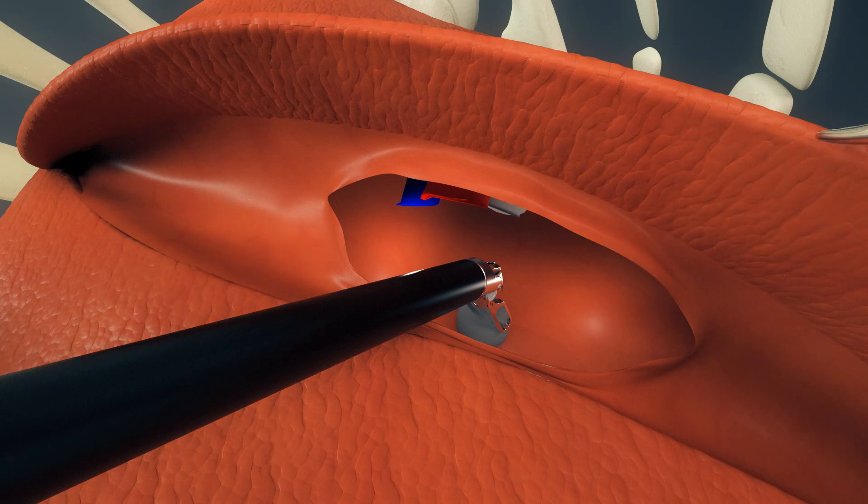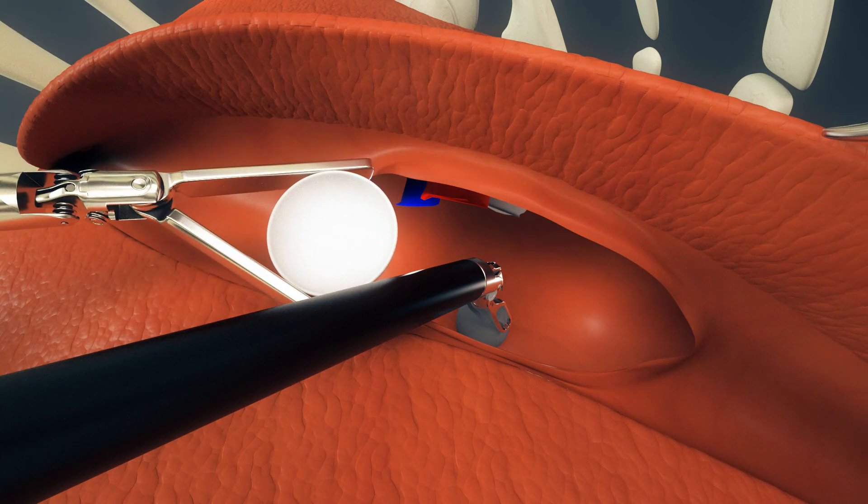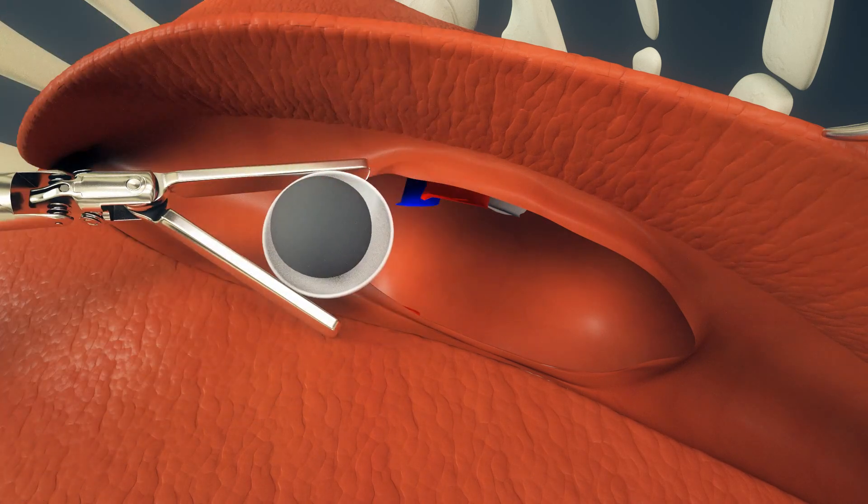After the lobe is detached, it is placed in a special bag and removed through one of the incisions. A drain is placed and the remainder of the incisions are closed and dressed.